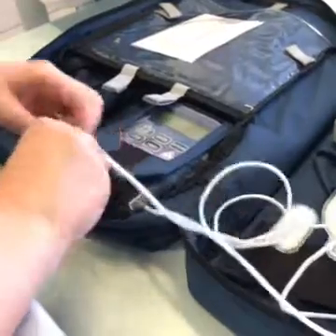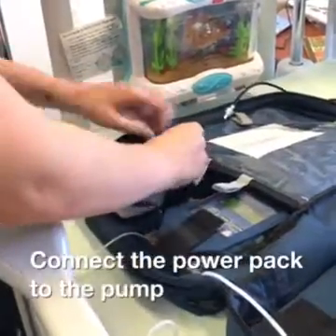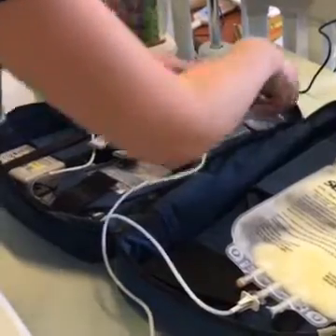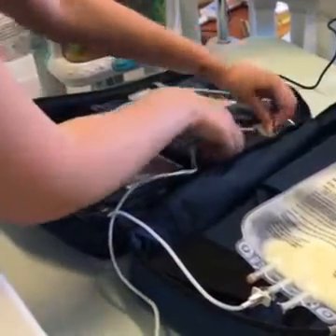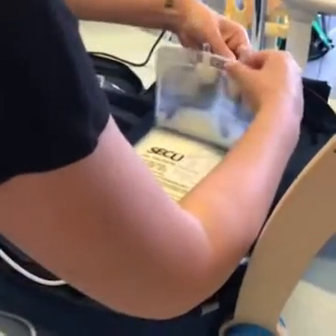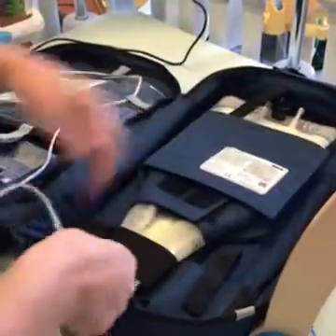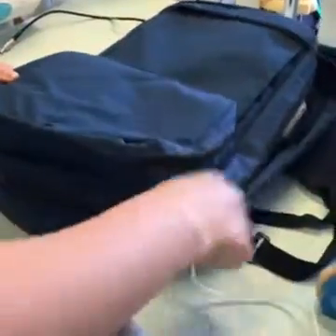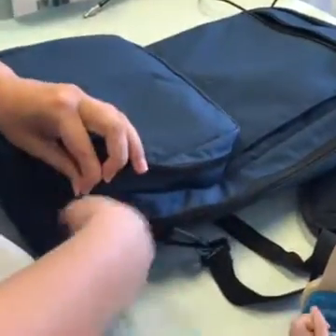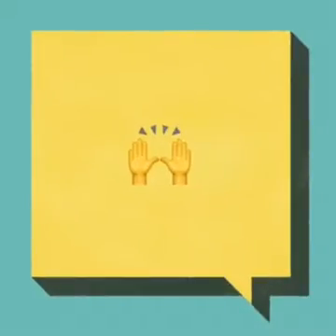Place the pump in the backpack. Connect the power pack to the pump and place the power pack in the backpack as well. Secure the PN tubing in the backpack using the velcro attachments, then place and secure the PN bag into the backpack. Do up the backpack zipper with the tubing coming out of its fabric opening. Keep the backpack upright during the infusion, and you're all done.